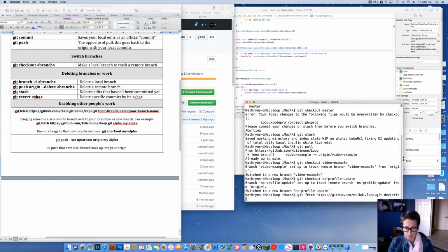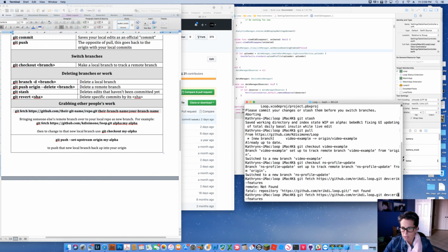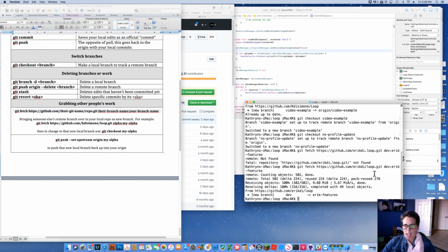Eric features. Oops, excuse me. I must have spelled his name wrong. Or I did this wrong. There we go. Got that right this time. So what I'm doing is I am now pulling in his dev branch.